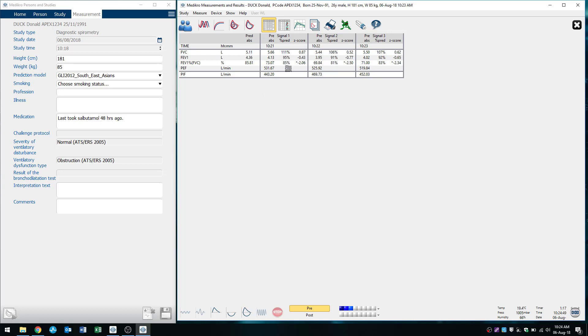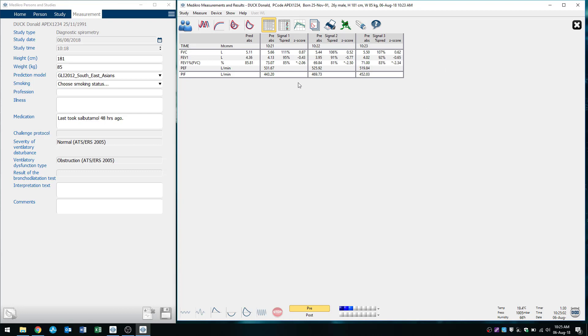So you can see here there's trial one, trial two and trial three. And we can have a look at how acceptable and repeatable our values are. So my FEV1 in my first trial was 4.13 and my second trial was 3.95 and then my third trial was 4.02. My FVC in my first trial was 5.66, second trial was 5.44 and 5.55.